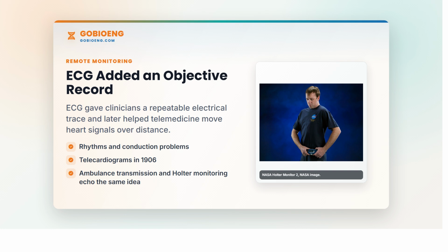Heart cells depolarize and repolarize in an organized sequence. These electrical changes spread through the heart and create voltage differences that can be detected at the skin. ECG electrodes do not inject electricity into the heart. They measure differences in voltage at the body surface. A lead is not just a cable. In ECG language, a lead is a view of the heart's electrical activity. Different leads look at the same cardiac event from different directions.